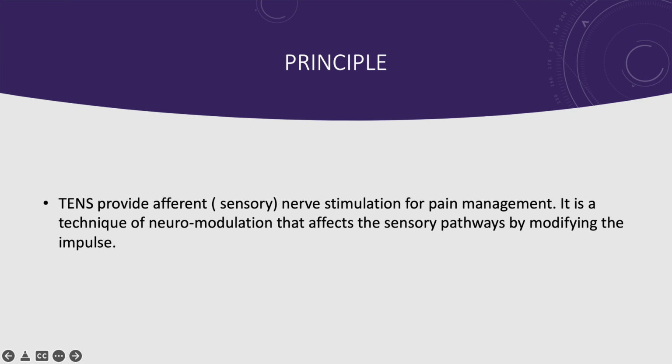So let's see the principle of TENS, or transcutaneous electrical nerve stimulation. TENS provides afferent nerve stimulation for pain management. It is a technique of neurostimulation that affects the sensory nerves by modifying the impulse. So it's a neuromodulatory technique which affects the sensory pathways by modifying the signal.